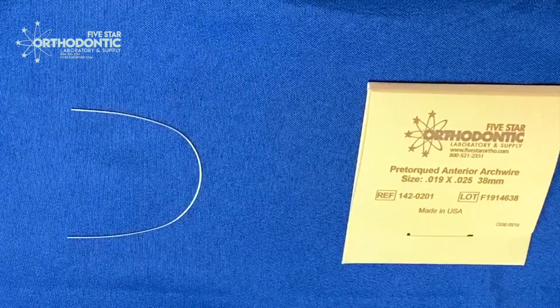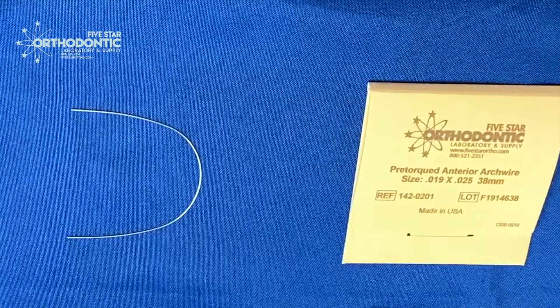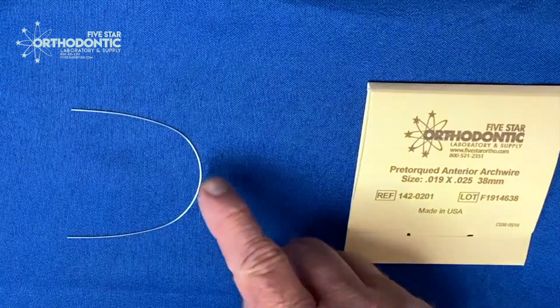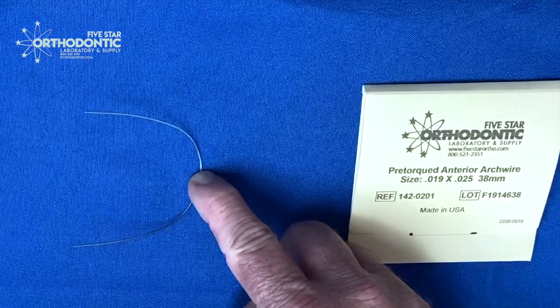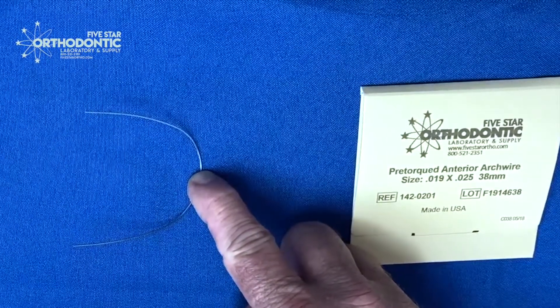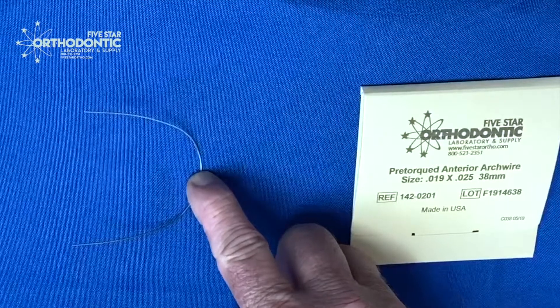The easy way to determine how this wire is used: just lay it on the table, and take your finger and push it down. Do you see how it pops up? If it pops up, it's going to flare the maxillary anterior teeth outward.